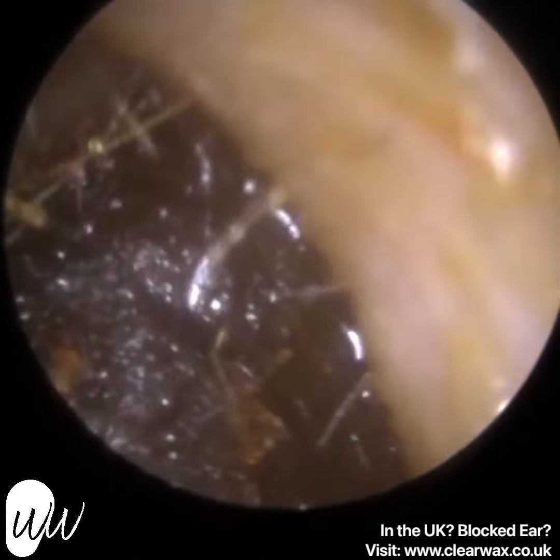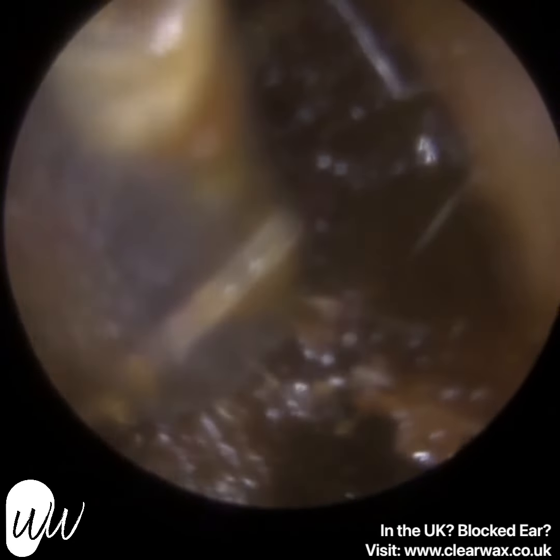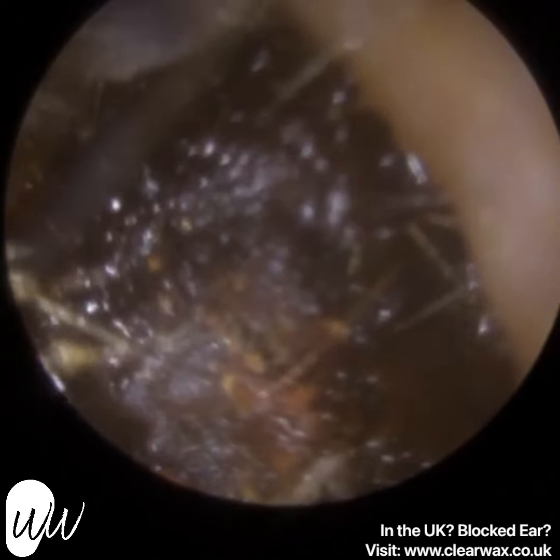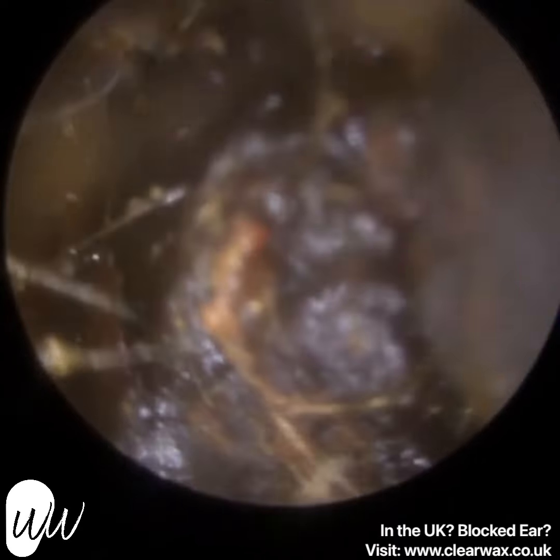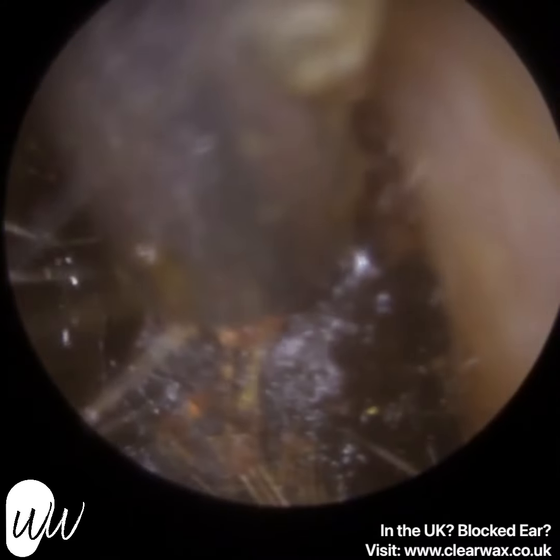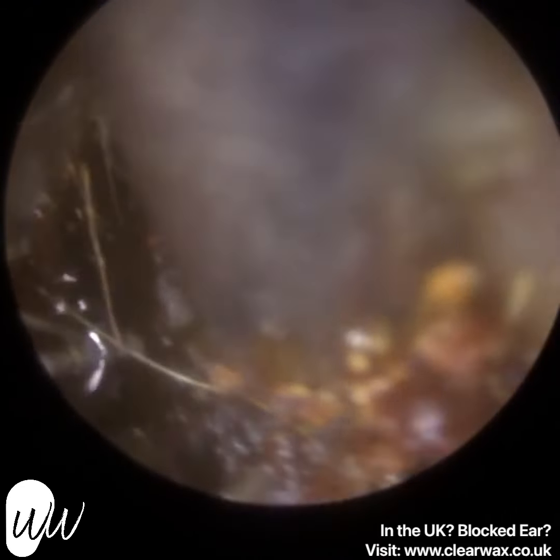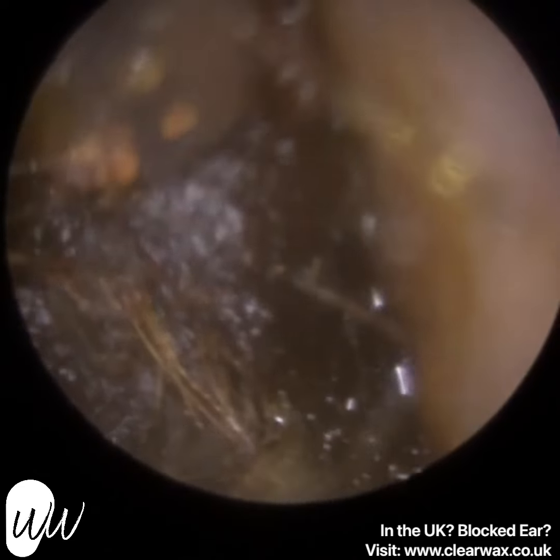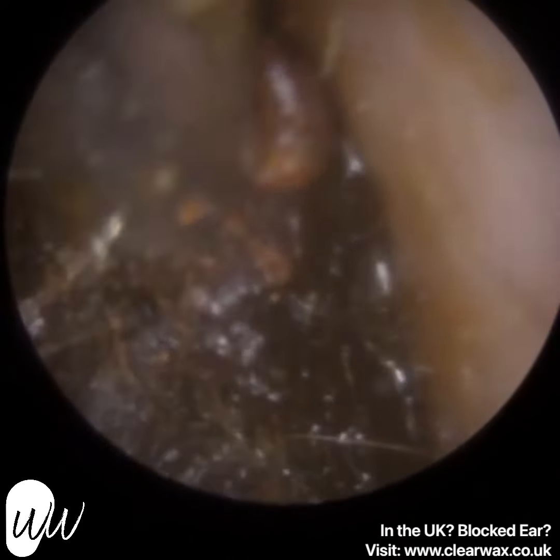So I'm going to use an ear hook in a moment, which you'll see. It's difficult using any other instruments. Forceps, of course, it's just too mushy. It's just going to cut through it. A Jobson Horne, initially I couldn't really use it because the wax plug was too deep in. And to glide that around the wax, in and behind, you're going to be making contact with the eardrum potentially, and definitely against the canal wall, which would be sensitive for the patient. A hook is a lot more manoeuvrable. It's thinner, it's less surface area. We can better glide it in nooks and crannies without it being uncomfortable for the patient.